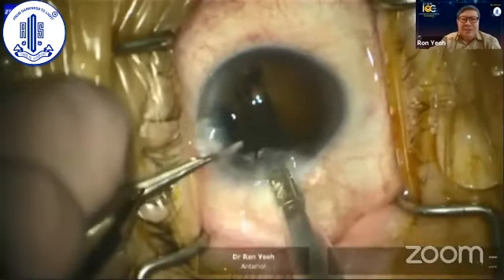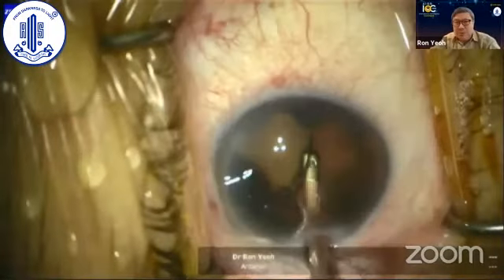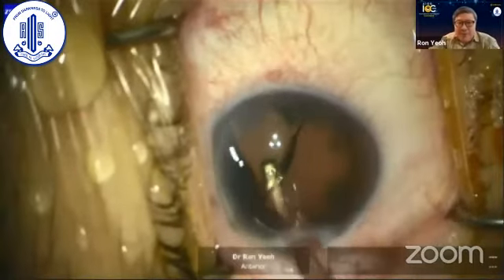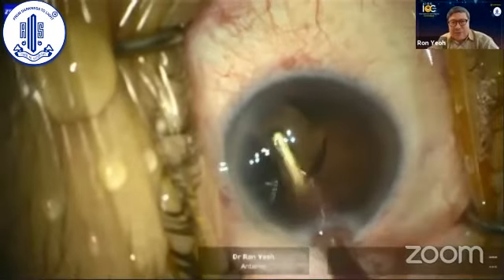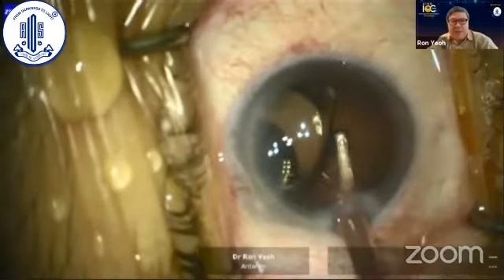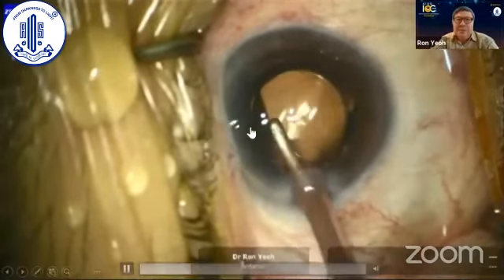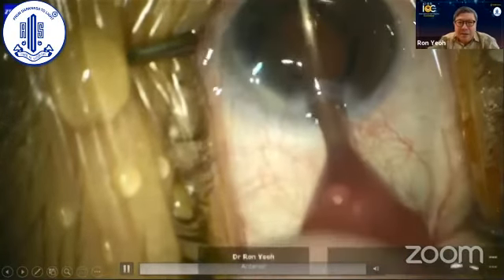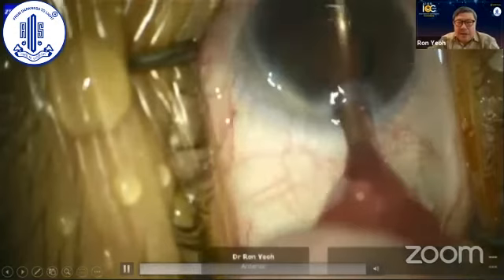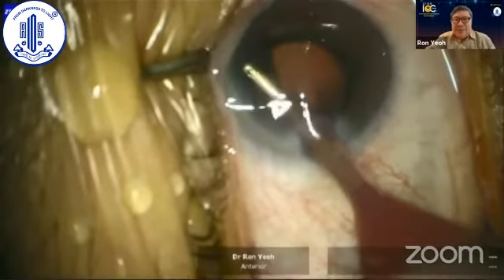Okay, I think this was actually the new Synergy lens that I was putting in. I was also going in behind the lens to remove the OVD. And if you can tell me why this capsule ruptured, I'd be very grateful. So I was just aspirating behind, come forward, and there's another line, okay? You see that line there? There's a line up there just under my IA tip. Again, I thought, gee, wow, good things certainly don't come alone.